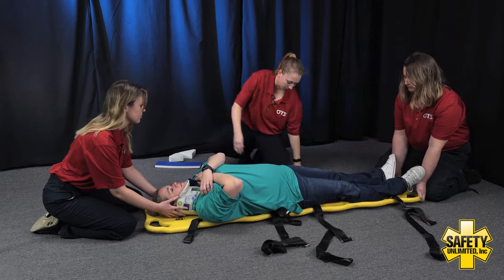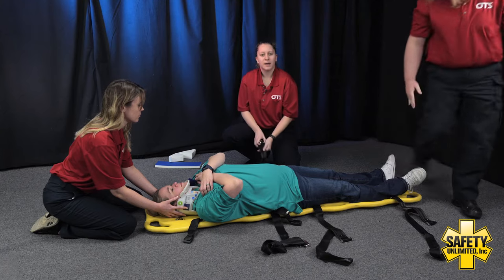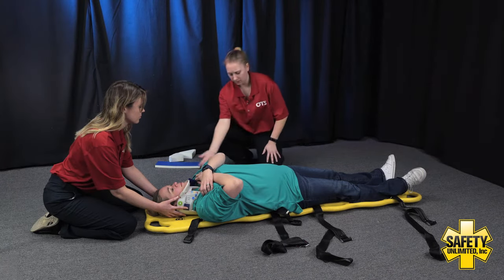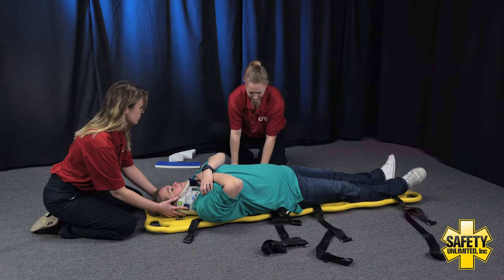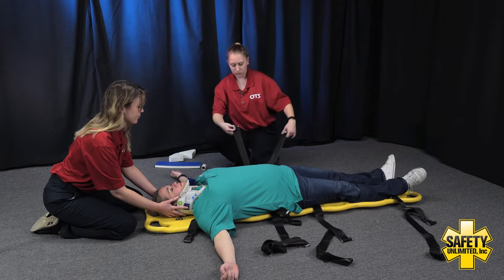You can go ahead and set down the bottom of the board. Thank you, EMT assistant. Before we get the straps, I'm going to make sure to pad any void areas — this is going to be under the patient's legs if necessary, focusing on that back and anything behind the head. So I would go ahead and pad those voids. Patient, if you can go ahead and put your arms out to a T for me. We're going to start with our torso straps.